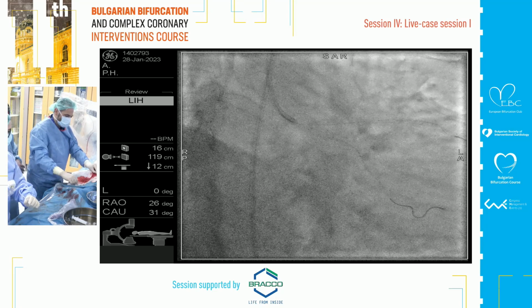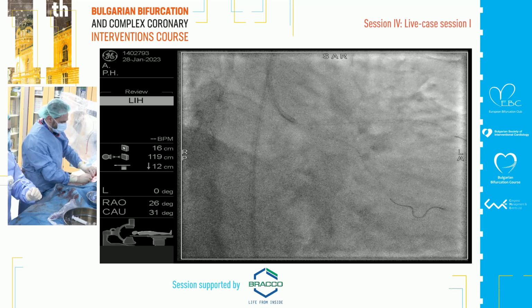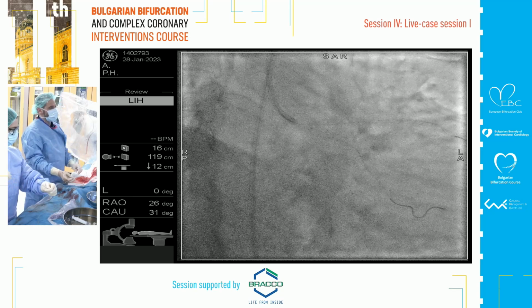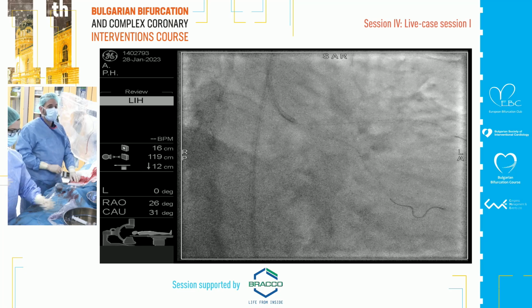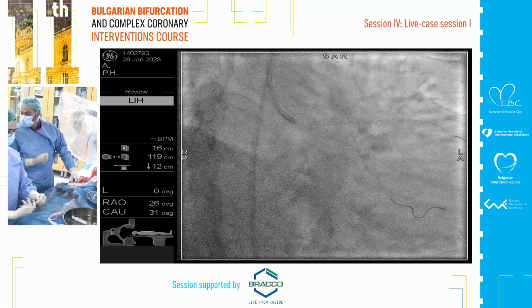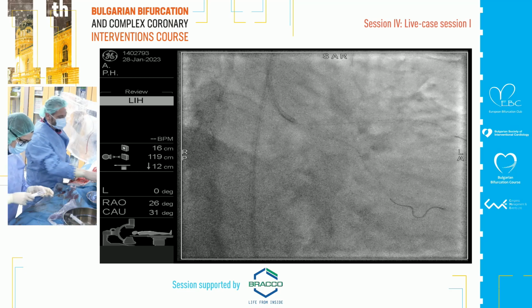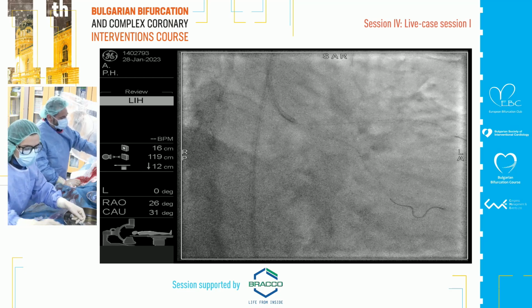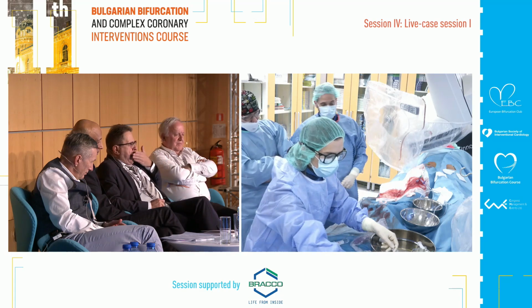Yeah, of course. 3.5. Right? This one or no? I think it's even worse. I'm more confident that we go there. The problem is that the stent is small. So you are doing pot side pot, you said. Yeah, pot side pot. I was in favor of pot side pot rather than kissing now.